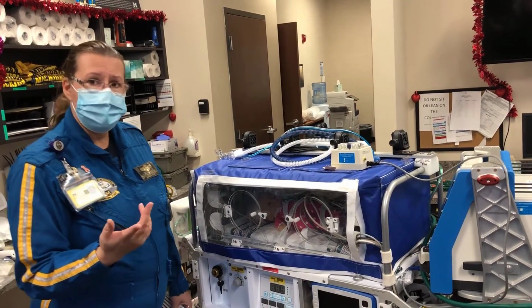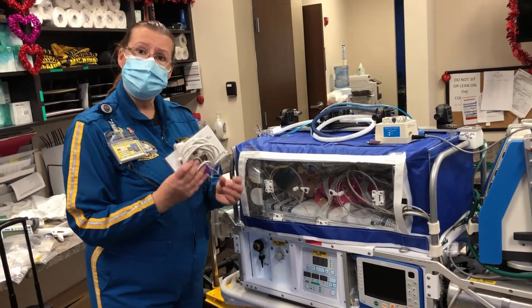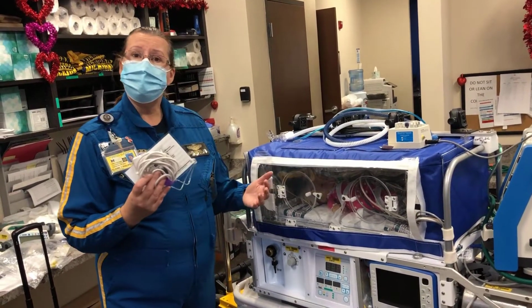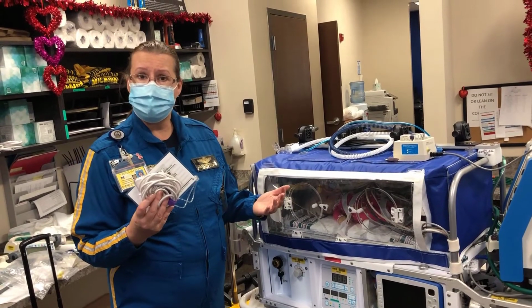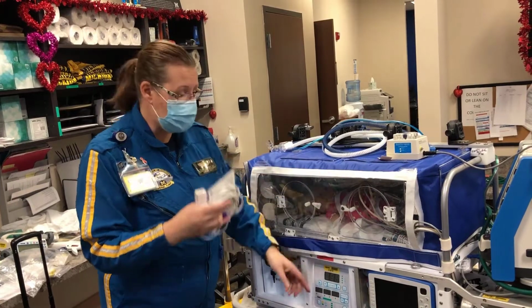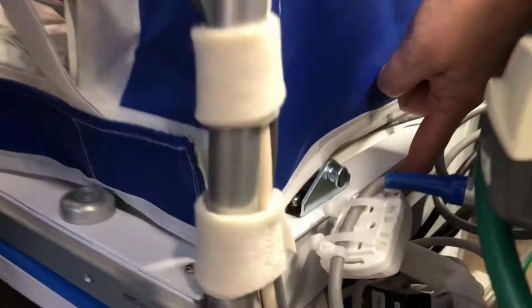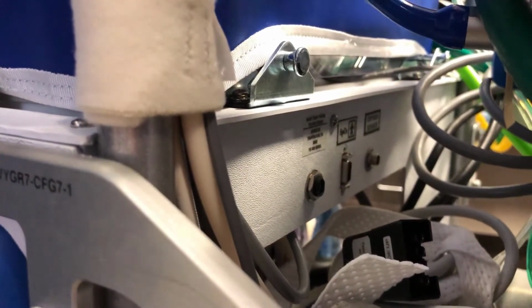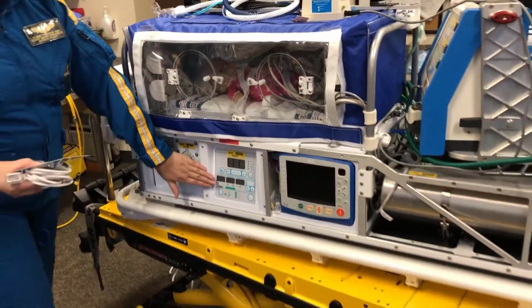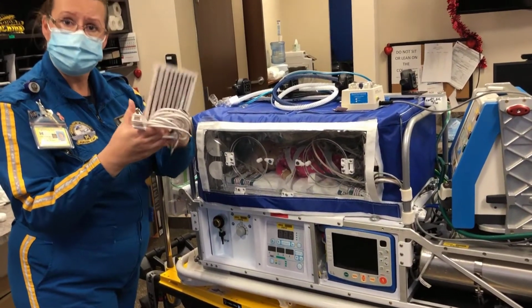A couple more features about the Isolette that is new. The heater does have a pulse ox capability. So if you wanted to do pre and post ductal continuous pulse oximetry, there is an extra cable tucked into the back of the Isolette. It plugs in right here. So if you had a pulse ox failure, you have another option to do that. And the instructions for how to turn it on are on the card.